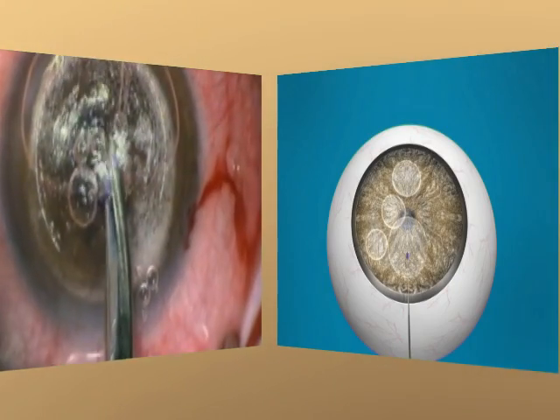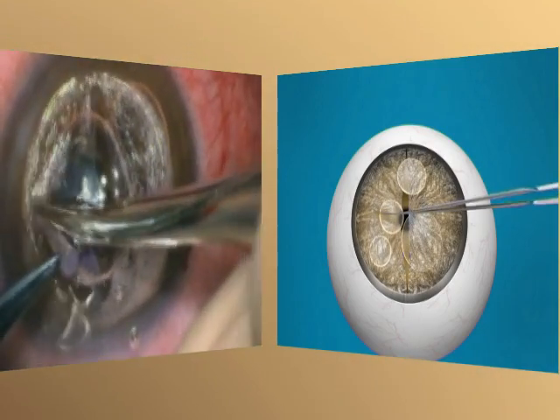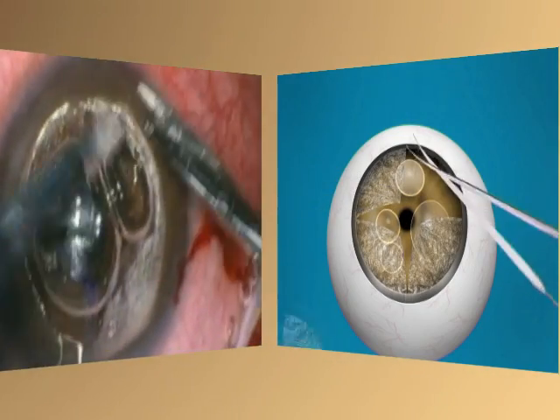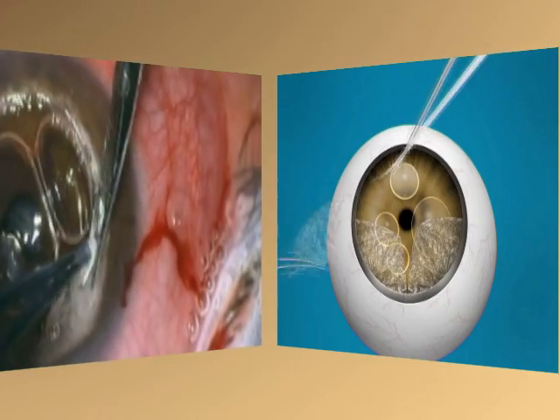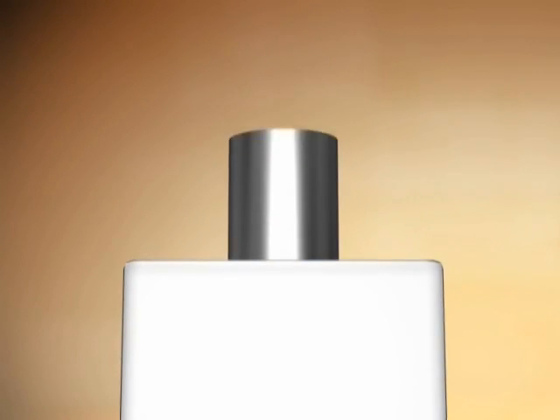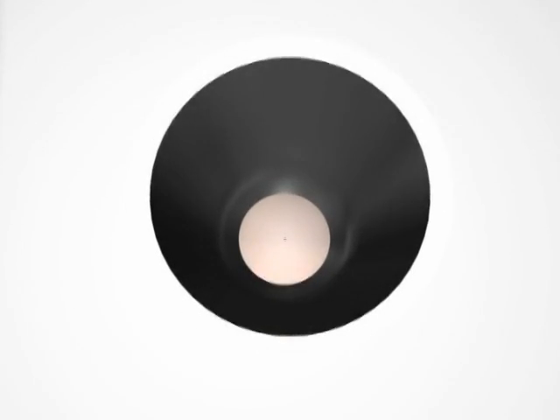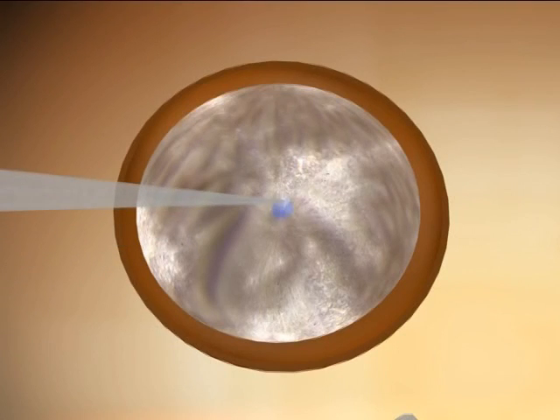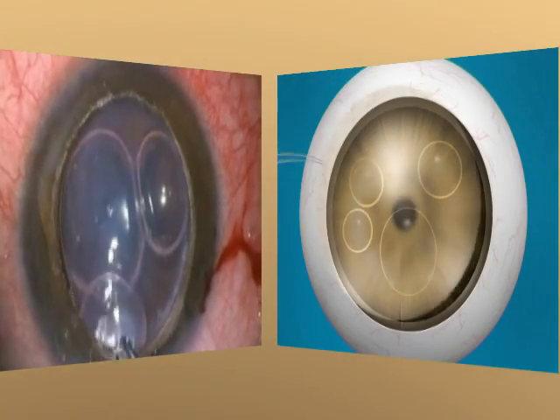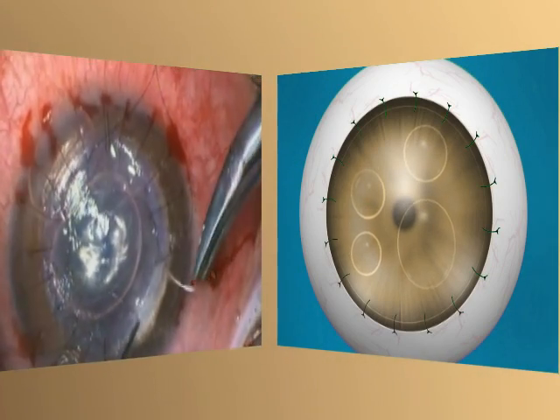A pair of blunt-tipped curved Vannas scissors was used to divide the thin layer of the posterior corneal stroma tissue into four quadrants, and each quadrant was subsequently excised, baring the Descemet's membrane completely. A 0.25 mm oversized donor lenticule was punched from the endothelial side and its Descemet's membrane was removed after staining with 0.06% trypan blue dye. The donor lenticule was then secured with 16 interrupted 10-0 monofilament nylon sutures.